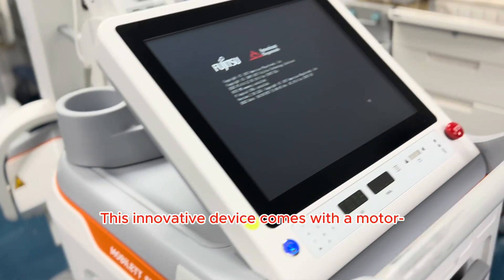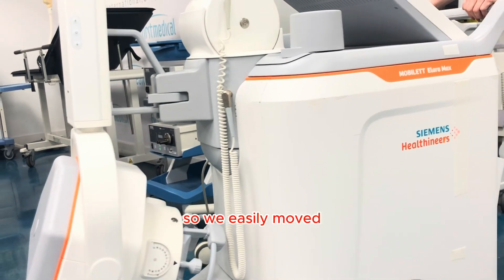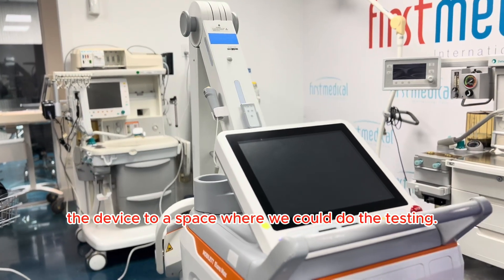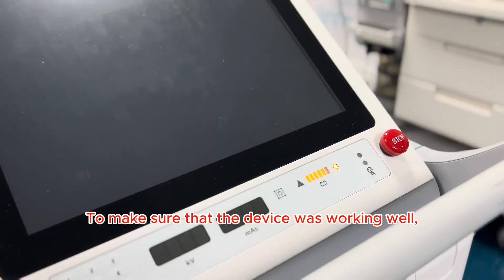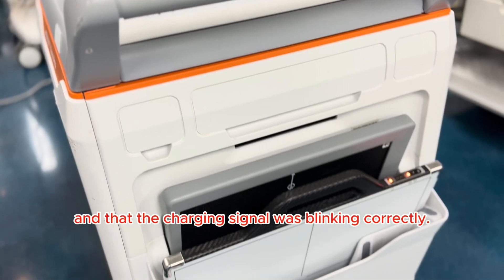This innovative device comes with a motor-assisted drive for trouble-free movement, so we easily moved the device to a space where we could do the testing. To make sure that the device was working well, we checked that its battery was fully charged and that the charging signal was blinking correctly.